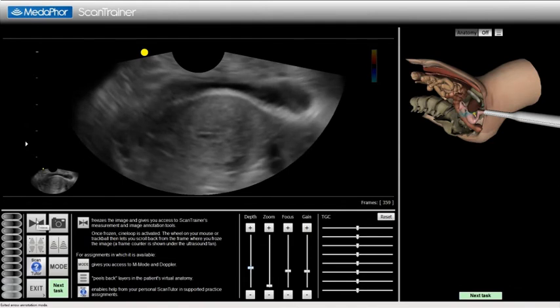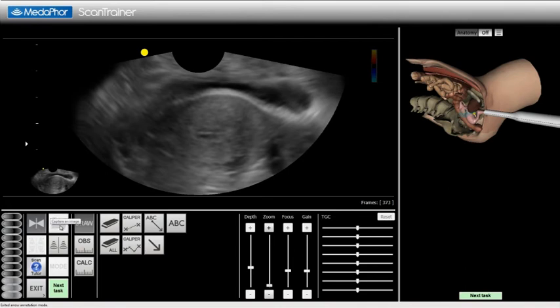I then freeze the ultrasound image, I capture an image, and then I keep the ultrasound image frozen. Identify the patient's right and left sides. I now draw an arrow on the ultrasound image from the patient's right to the patient's left side. I keep the ultrasound image frozen.